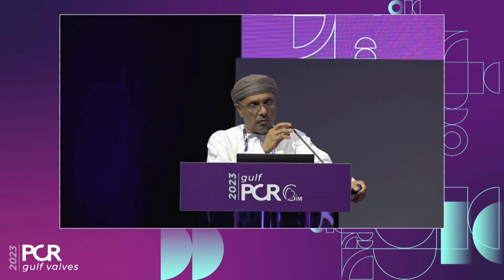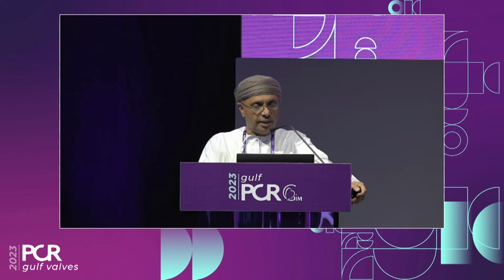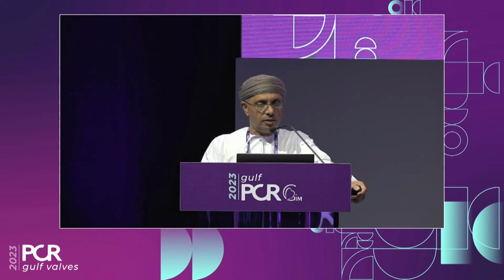Wael, Dr. Fadi. I'm presenting two cases. One of them live in a box using the Navitor system. The first case will be live in a box in a horizontal aorta. So we'll start.